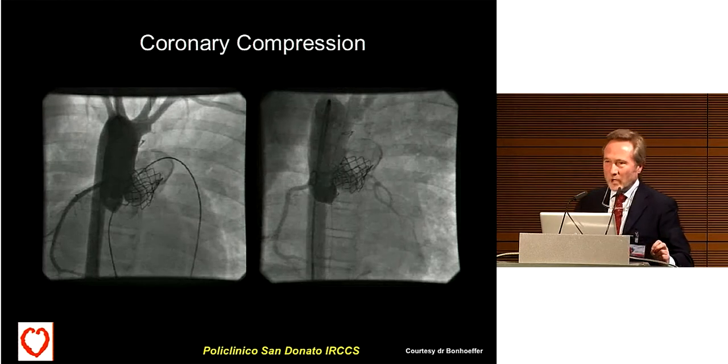Well, coronary compression. This is the pioneer experience reported by Philipp Bonhoeffer, where the LAD was completely occluded after implantation of the stent. Luckily enough, in this particular case, that probably Neil Wilson is well aware of, after chest compression, it was strong enough to squeeze the stent and restore the flow in the left coronary.